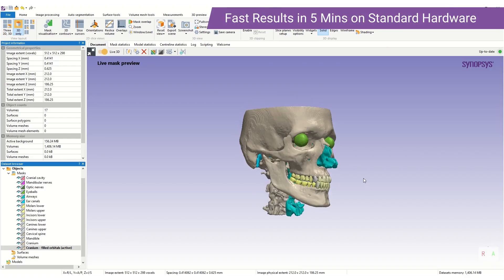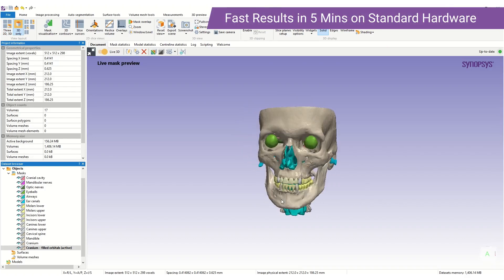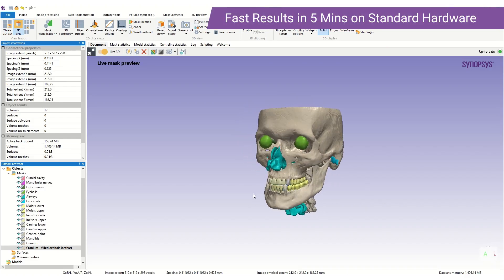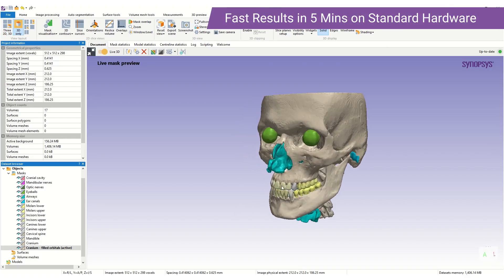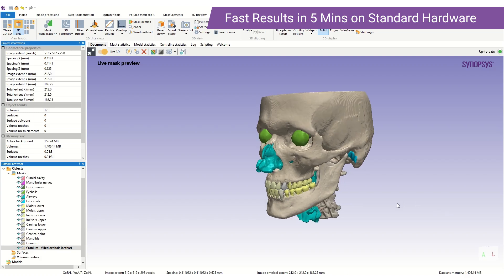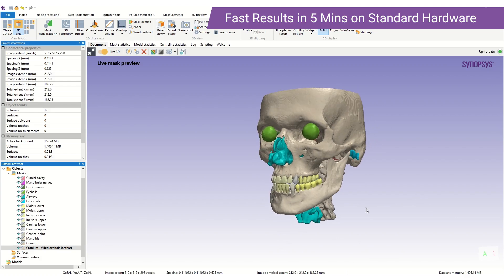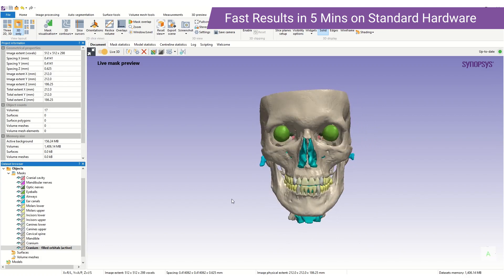The meshes produced by the CMF auto segmenter include the cranium, mandible, cervical spine, teeth, ear canals, airways, eyeballs, optic nerves, mandibular nerves and the cranial cavity.